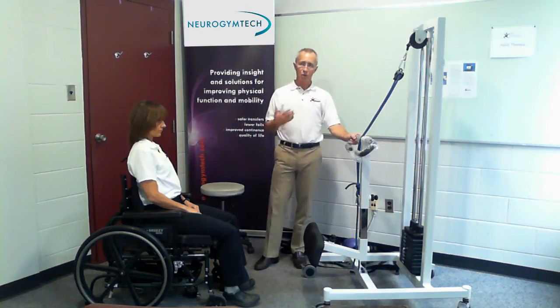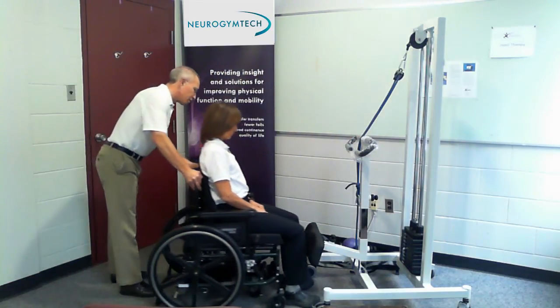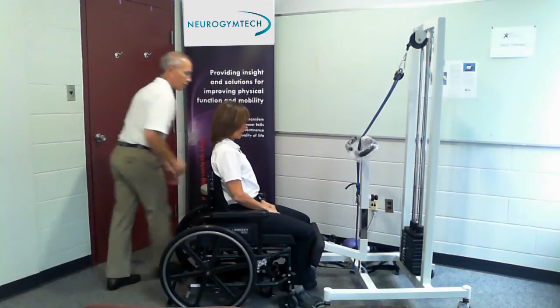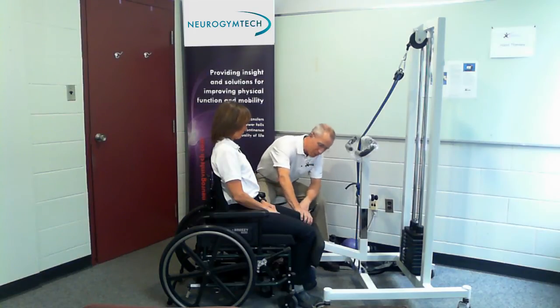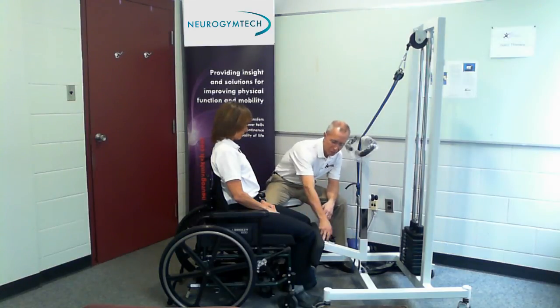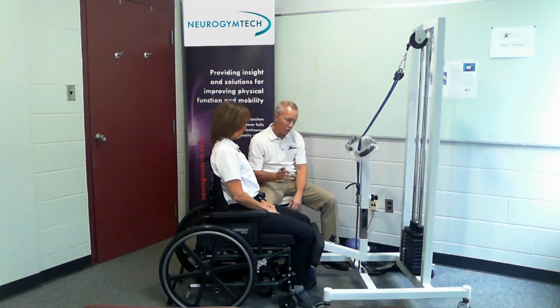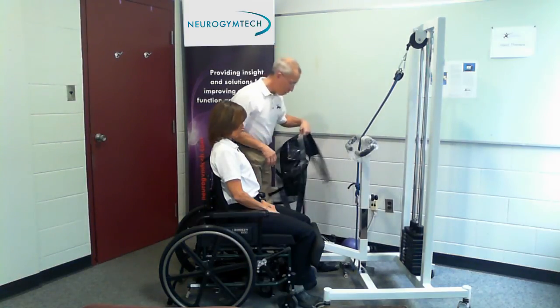The first thing you want to do is put the patient in the machine, so we're going to wheel the patient up, then remember to lock both the wheelchair and the sit-to-stand trainer wheels. The knee pad should be just below the patella, and the tibia should be angled back a little bit. Typically for most people you should have the pad so you just see the chrome — we'll show you some applications where you'd have something more than that. So let me put her in generically, and then we'll go through the four applications.